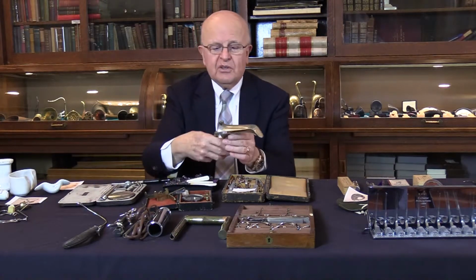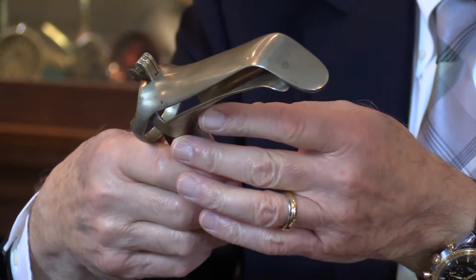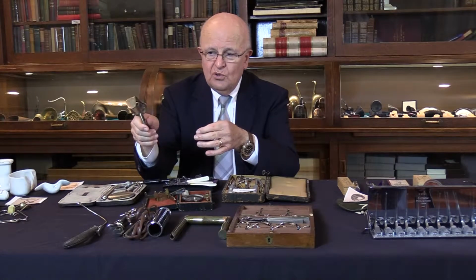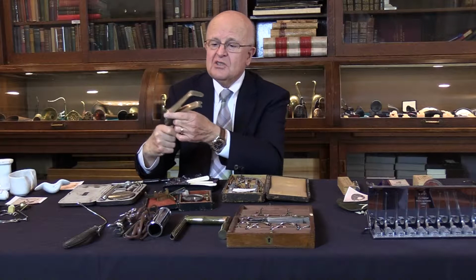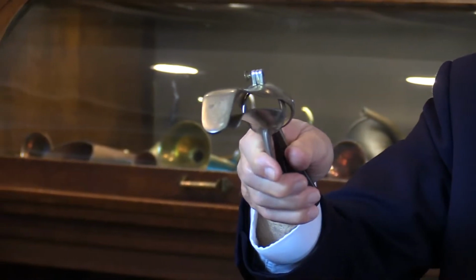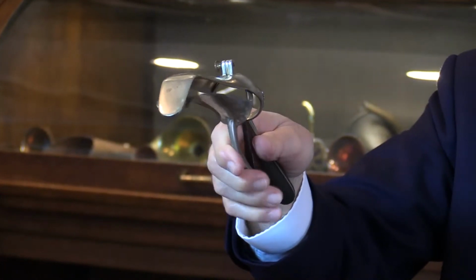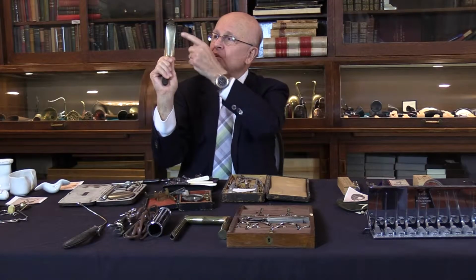This is a very clever tool here. It looks like a vaginal speculum, but actually it's for laryngoscopy. What you do is it depresses the tongue here, and there is a mirror here to see the larynx. So with one hand, you just put it here, instead of holding the tongue blade and the mirror with the other hand, the old-fashioned way. With one hand, it does both functions. And that's the mirror here.